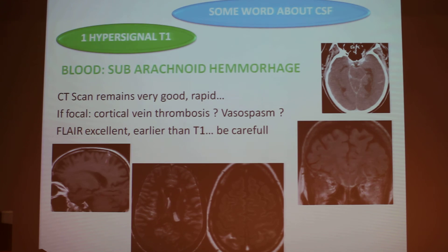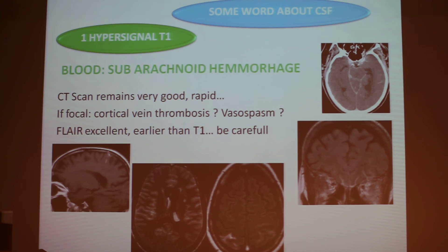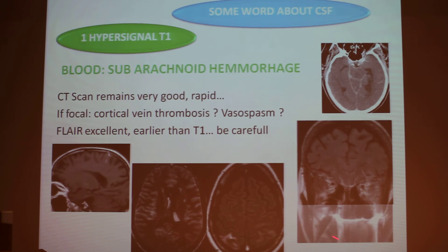And be very careful when you have the images — always look at all the images. In this patient we saw an image which is very strange, looking like a frontal subarachnoid hemorrhage. In fact it's just artifacts due to the teeth. So be very careful when you interpret FLAIR — as soon as you have metallic material in the mouth, all the images can be artifacts. You have to be very careful in your interpretation.